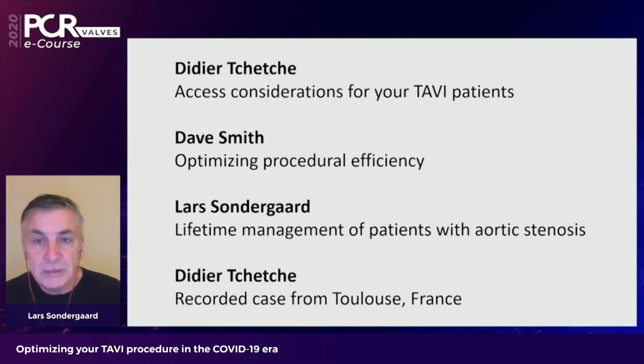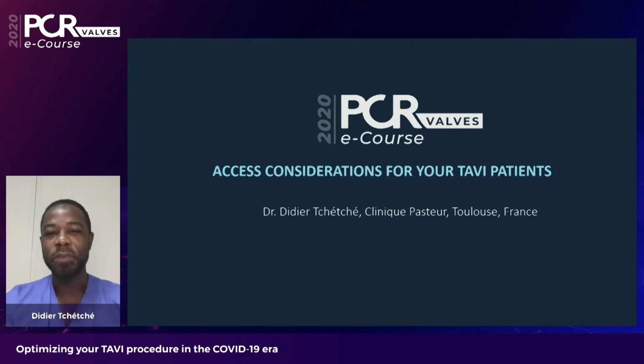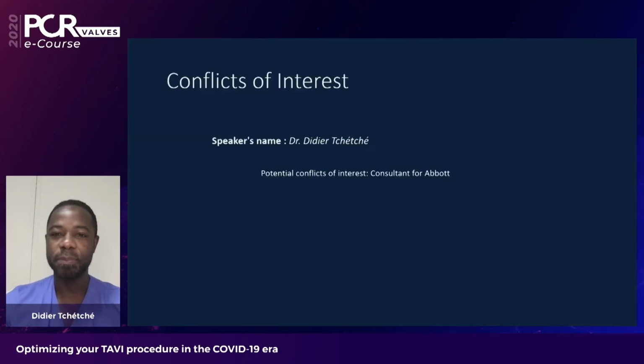So maybe, Didier, you can start off here to tell us about your consideration when you're planning a patient for TAVI. Okay, thank you very much, Lars. So access considerations for your TAVI patients.